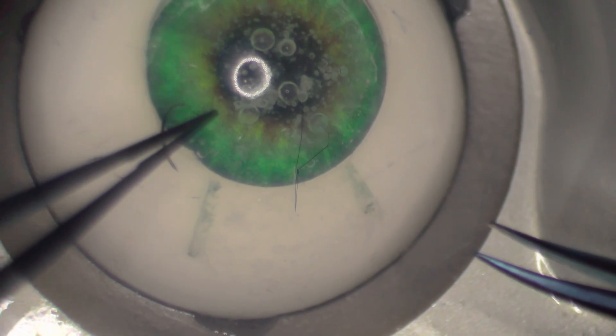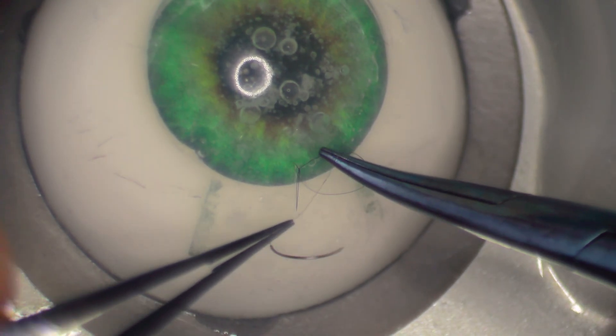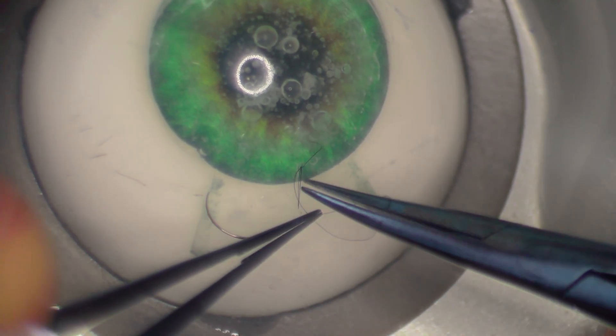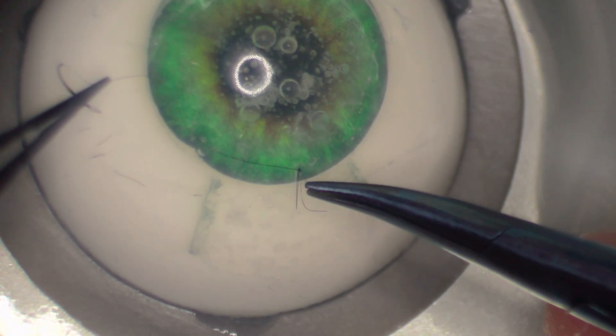In surgery, I usually use this moment to fill the eye with BSS and check if the wound is still leaking or if it's too tight and causing astigmatism. After that, I lock the knot. To lock the knot, you do one throw in the opposite direction and tighten it. Very important: do not move the knot until you've tightened it, otherwise it will loosen again.